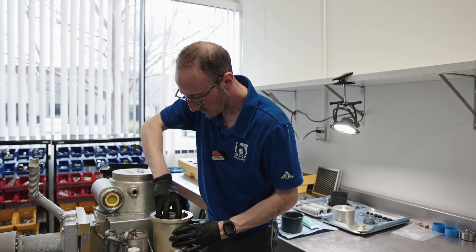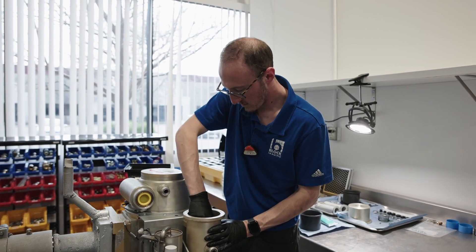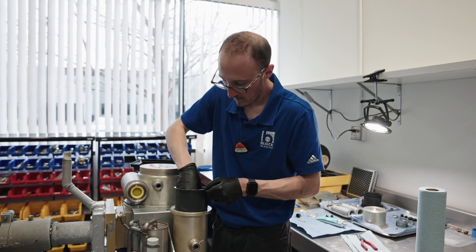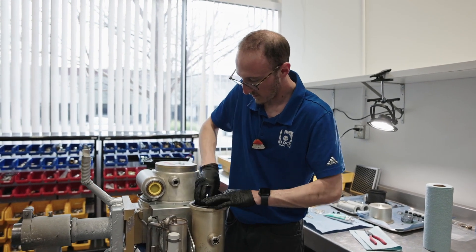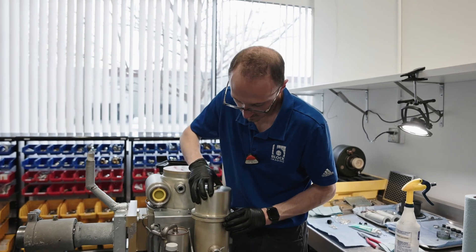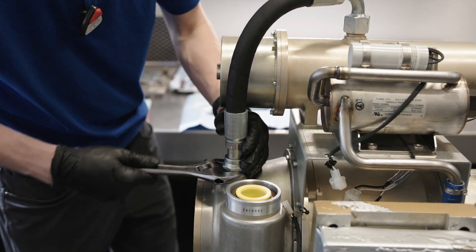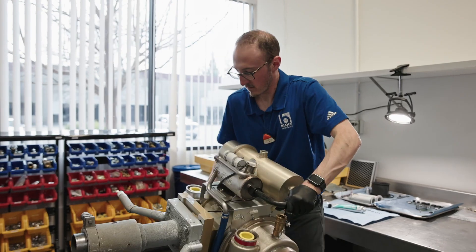There's a clear distinction between a refurbished or repaired CT tube versus a reloaded CT tube. Oftentimes failure can occur in the insert tube itself, and if that happens it requires a brand new insert tube to be inserted into that lead-lined housing and repurposed again — that is called a reloaded CT tube.